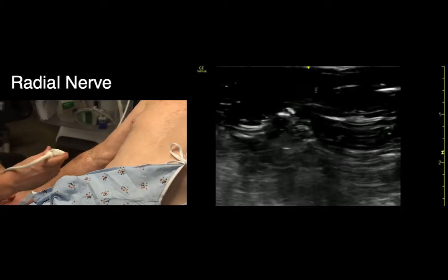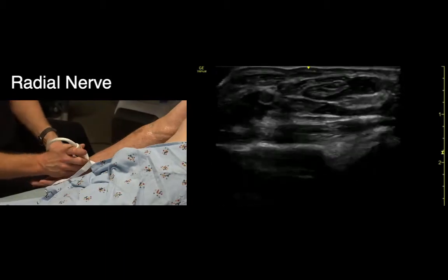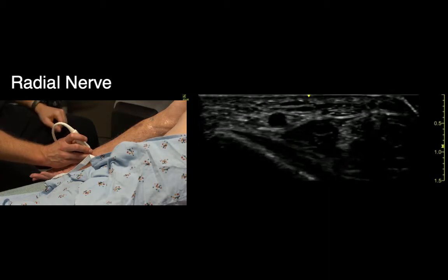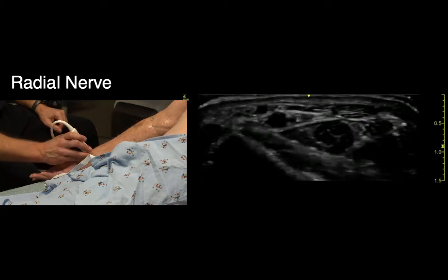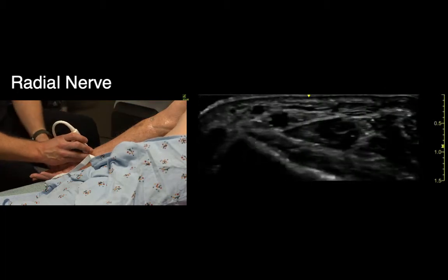To find nerves in the forearm, the first thing we do is find vessels, and I often start at the wrist to find the vessels first. You guys can see the radial artery right there. The nerve sits on the radial side of the radial artery, and the ulnar nerve sits on the ulnar side of the ulnar artery.